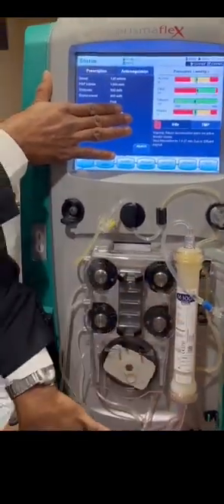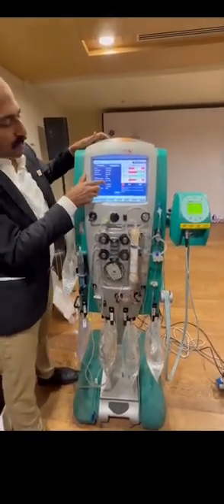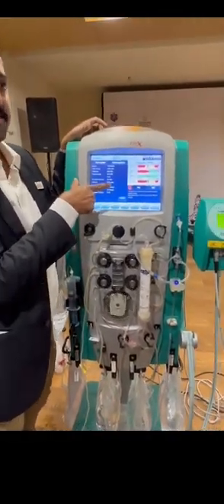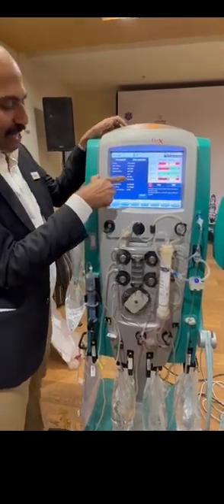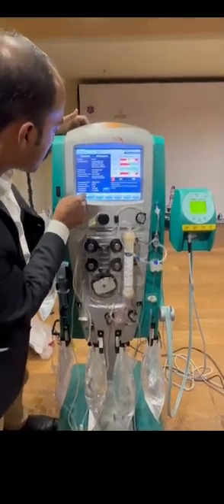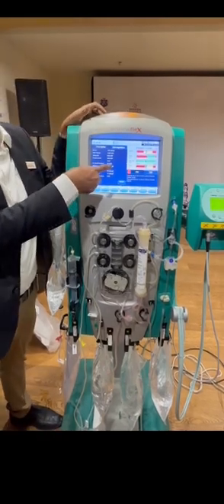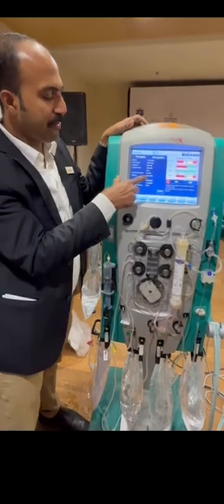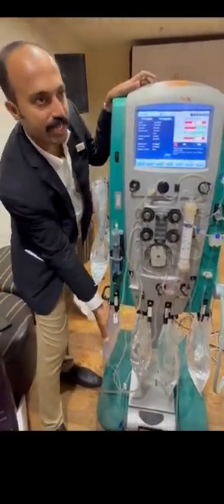We have to remove 2500 ml of solution per hour to the effluent. Now how much is it? 2570: 2500 adding the UF and calcium. 50 ml is the UF and 20 ml is calcium. So 2570 ml is the effluent which is coming into the bag in an hour.